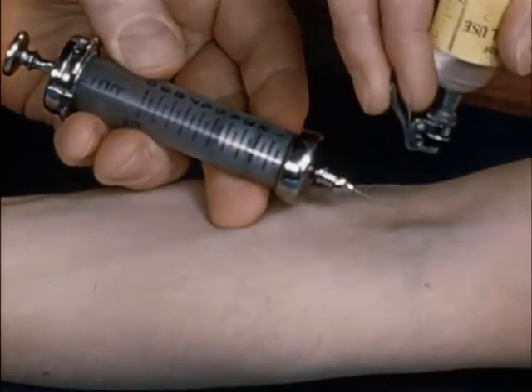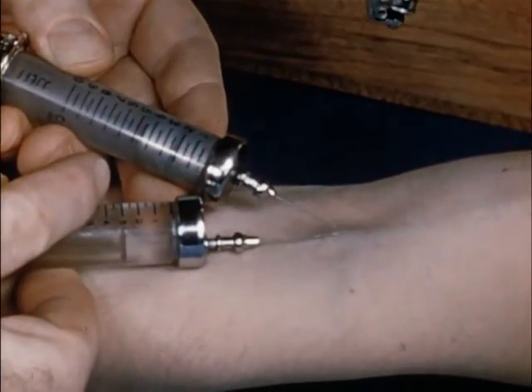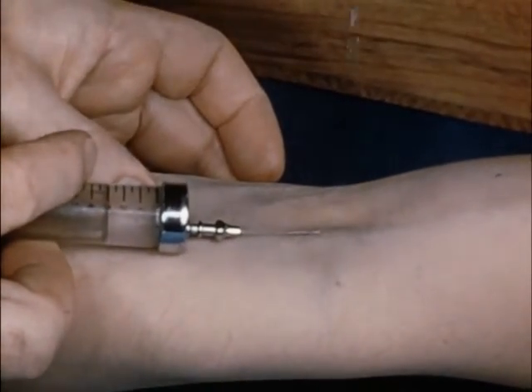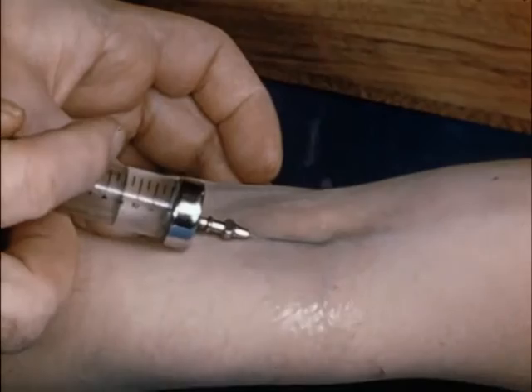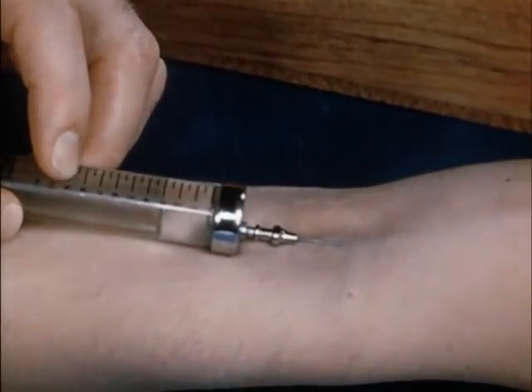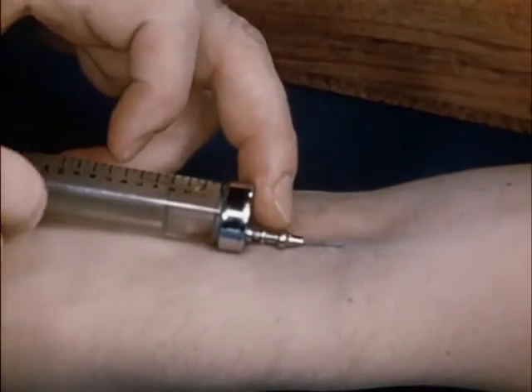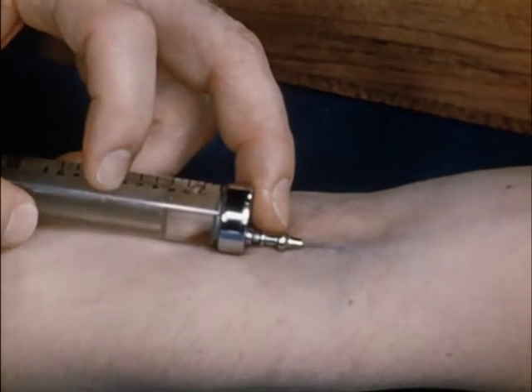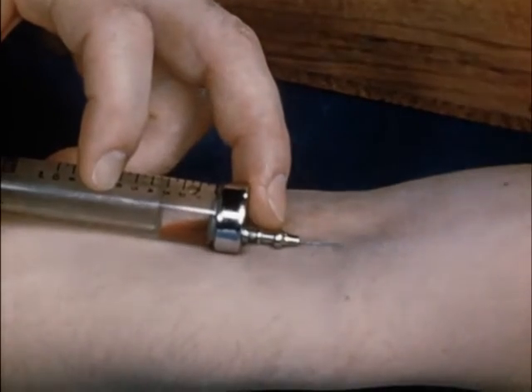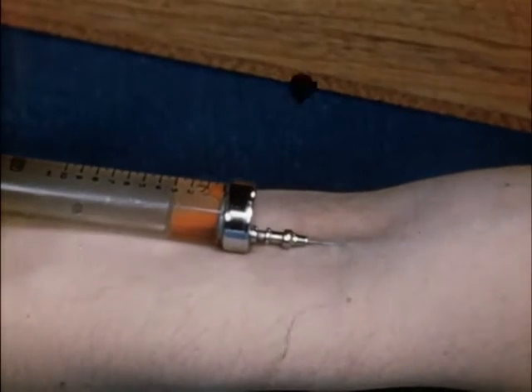The needle cannot be aligned with the vein as it could were an eccentric nozzle used. This disadvantage increases when attempting to enter a small or mobile vein. The greatest disadvantage of both syringes, however, is the difficulty of checking the intravenous position at any moment during the injection. It is essential for safety to be able to confirm this position by free withdrawal of blood from the vein. Here, as can be seen, after each successive withdrawal, greater quantities of blood cloud the solution, obscure the reading and cause further delay.